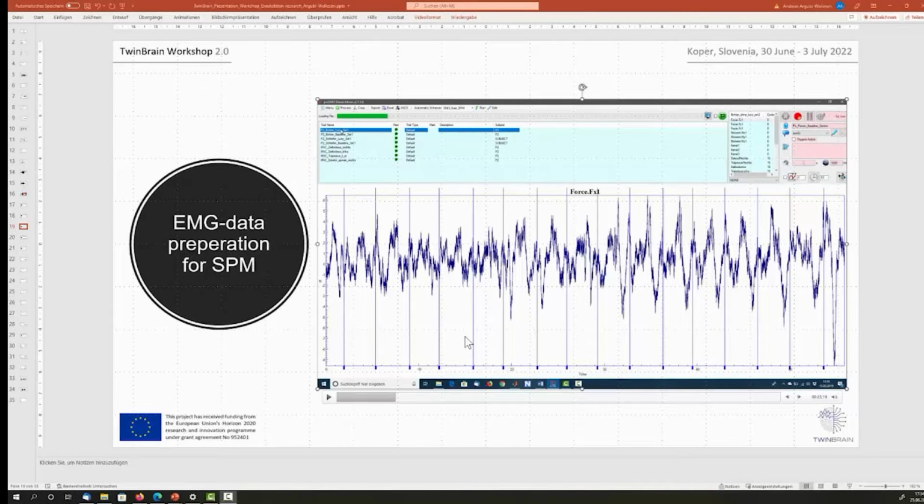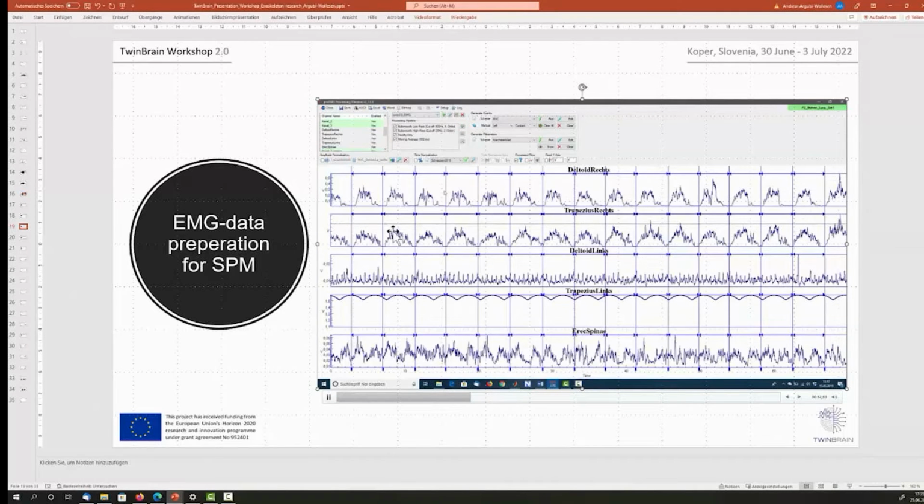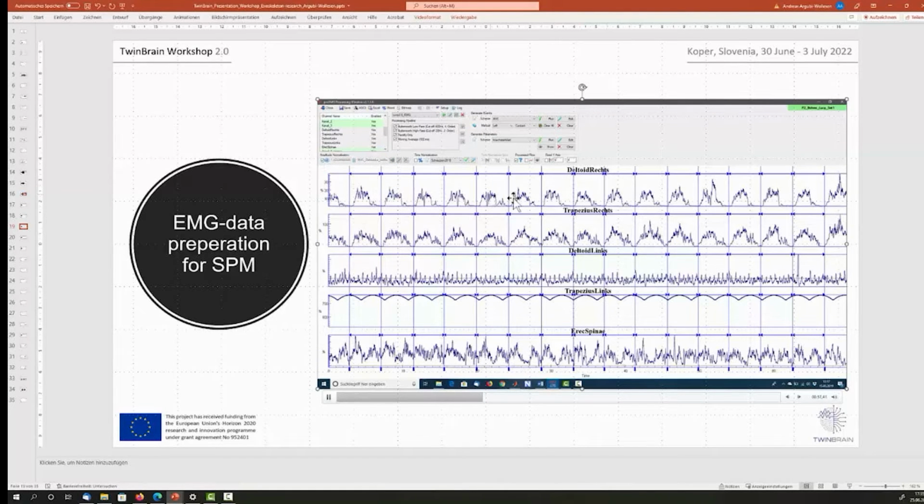Here I can show you the point in deleting the outlier cycles. We have here, for example, the data in Pro EMG. So this is the EMG data, and these points down here are the event markers that I showed you prior. We have all these cyclic motions and the EMG data inside the cycles, and you can see that, based on the different muscle activities, we have all these cycles that we recorded. In our case, we use the kinematic data and its outliers to identify cycles that we would take out and delete, also from the EMG data.